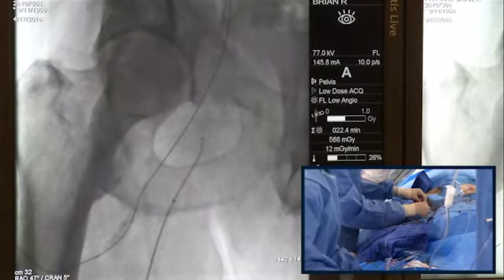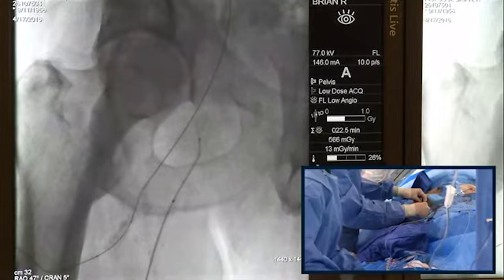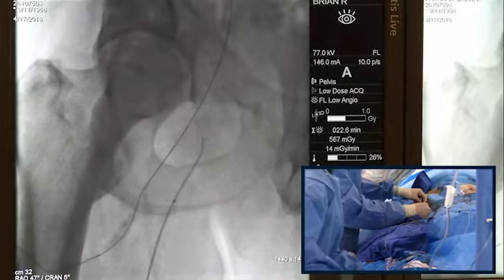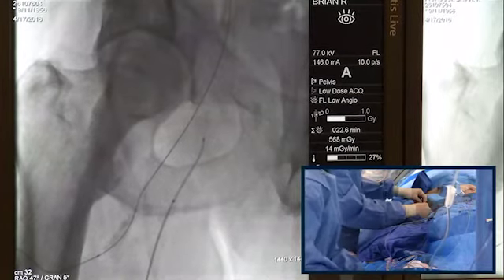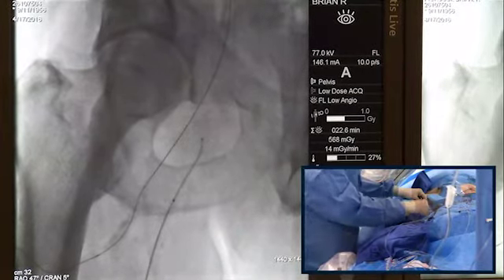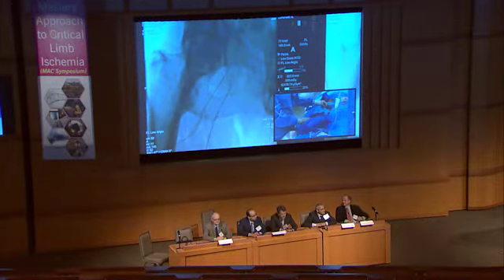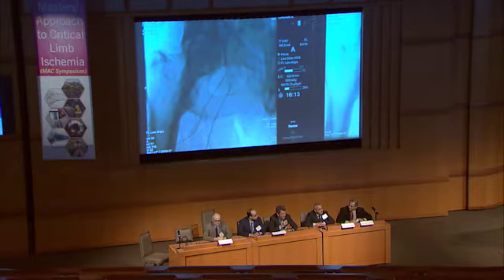This is not a regular vessel. This is a vessel that's had a lot of surgery. It's had traction applied to it, and there's a lot of talk in the surgical meetings that intervention often takes away surgical options. The truth is also a lot of surgery may take away another intervention options. Absolutely, I think these are now really one of the most challenging cases when, I mean, even if endarterectomy has been done on the proximal SFA, there's so much scar around. At the end, very often we end up with some re-entry devices from above, retrograde to come back here into the common femoral.